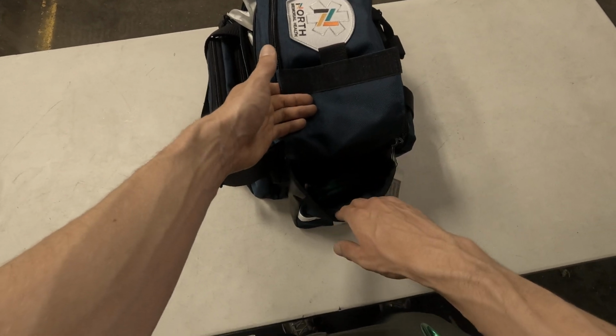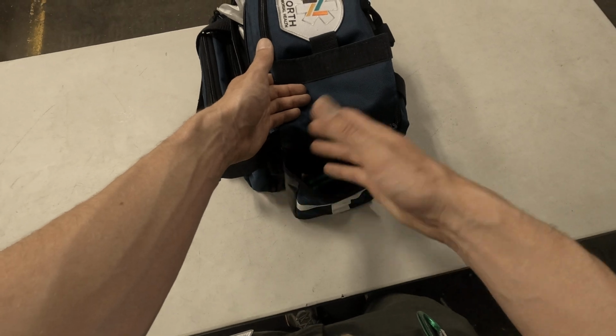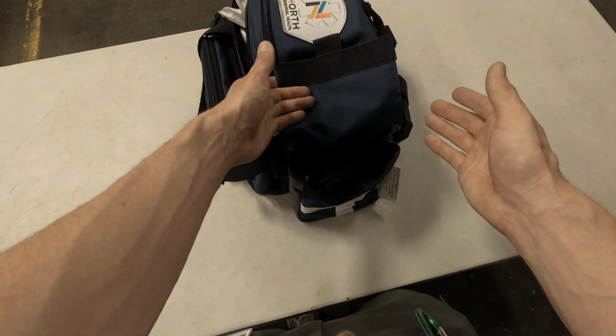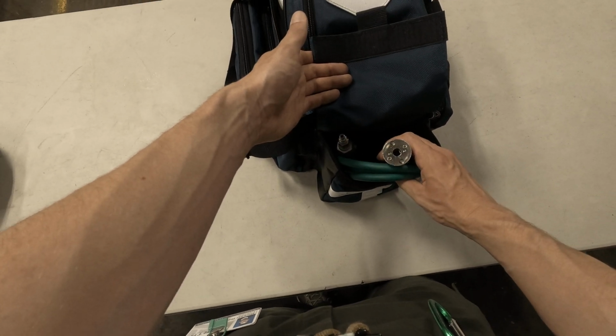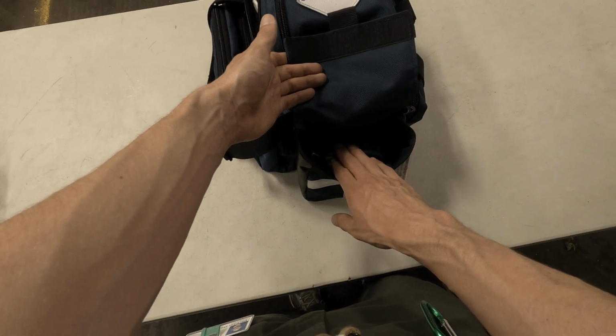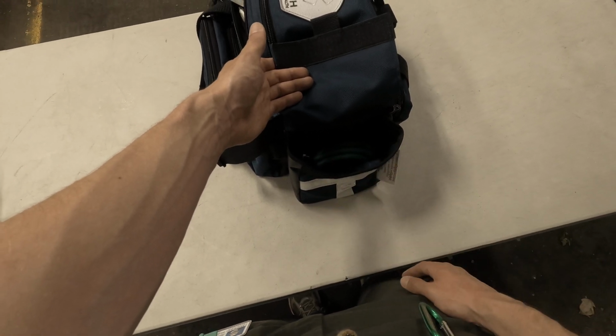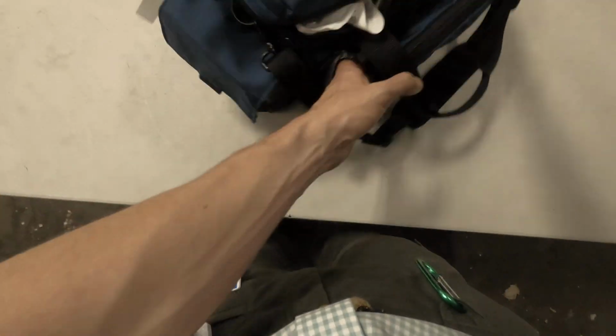But in most cases, when we're taking people up to the floor, that D tank is going to be just fine getting them up to the floor, and then we can switch them over. So I sort of felt that we would use it so rarely that it can be in the secondary bag, but I really do recommend taking it in a lot of the time just in case. You never know what's going to happen up on the floor.